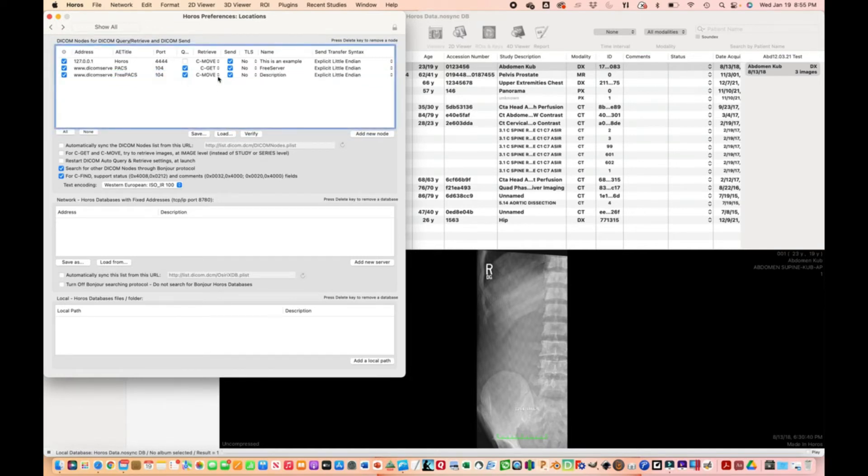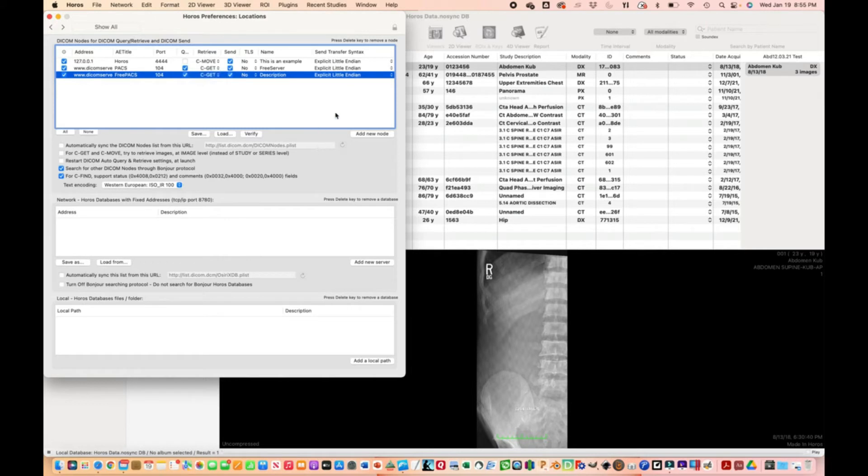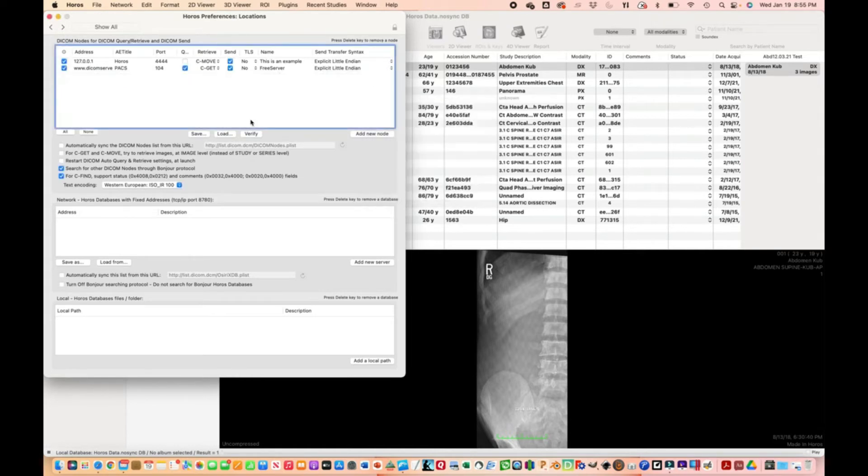Next item, for retrieve, go to C-GET. That's going to be good. I'm just going to delete this entry because I already have it.